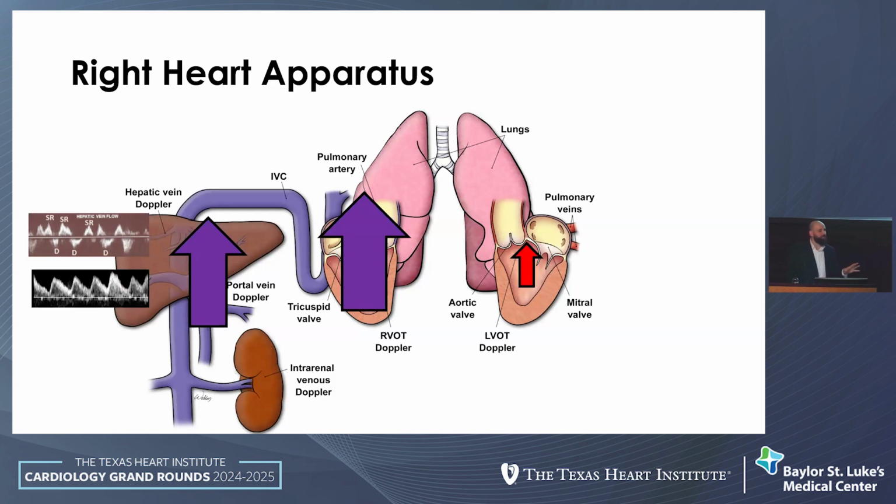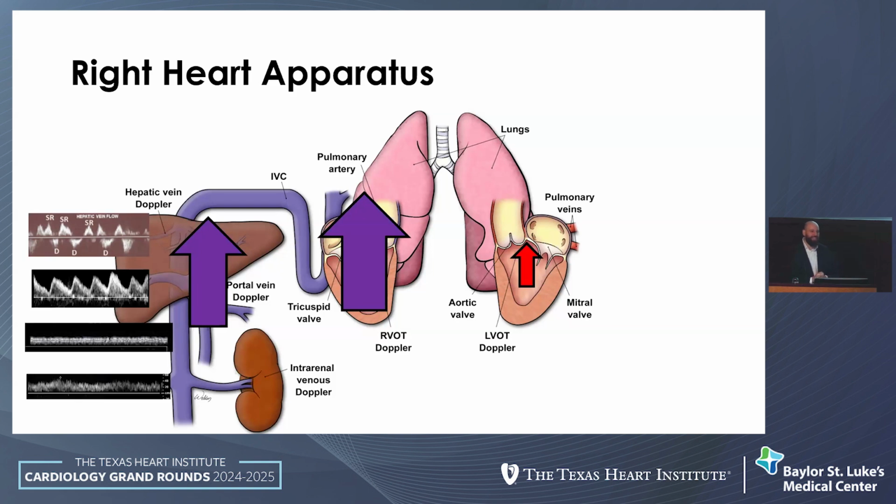A patient who has pulmonary hypertension, we know how difficult it is to diurese them and manage volume strategy because they are very preload dependent. But we can use the portal vein to diurese them. The question is, do you really want to diurese them to the point where they have monophasic flow? And the answer is no. Again, a very preload dependent state. You may want to give them a little more fluid and keep them a little bit on the pulsatile side. This is a very similar strategy I use for TAVR patients who have high risk for a suicide LV. You don't want to diurese them that much when you're optimizing them, so I make sure that portal vein is a little pulsatile before they go in for their TAVR.